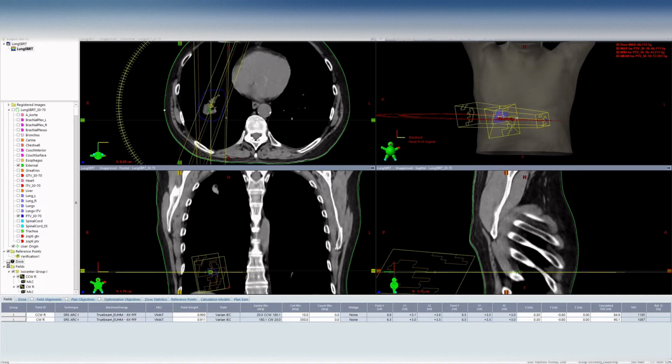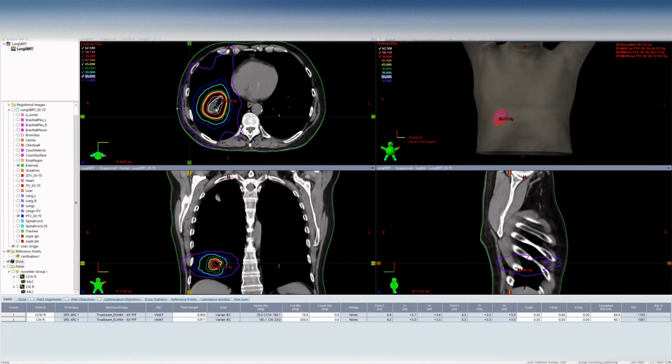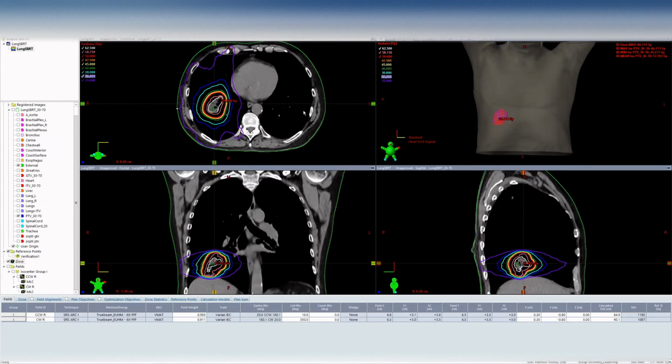So we've created this treatment plan, and so we have this dose. Well, it's a really high dose that's treated in a small number of fractions or treatments. And so we want to maximize the dose that's inside the target, but we want to minimize the amount of intermediate dose that's outside of the target. So SBRT, or stereotactic body radiotherapy, the goal is to put a high amount of dose into the tumor and have really sharp fall off.